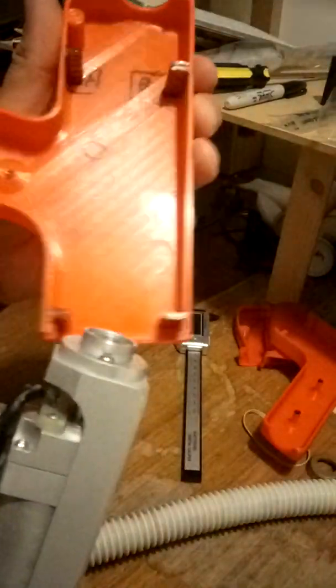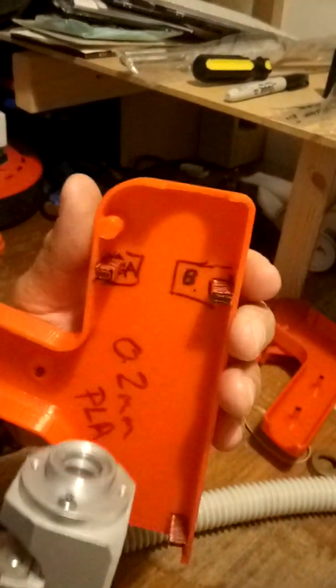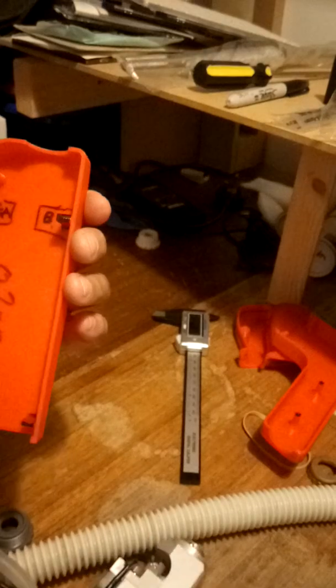And then obviously there's the same thing at the back here, these two, these little strengtheners. Now the reason why this is how it is, I'll show you in a moment. I'm not even sure that's going to fit, you know. Let's have a look. So the distance altogether in there, 53 millimeters. Right.